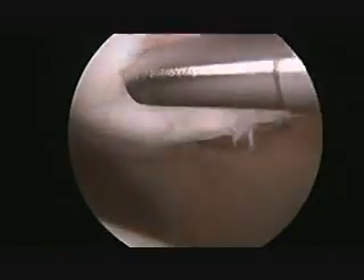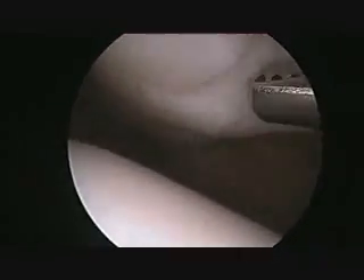A shaver is then used to remove any loose bone or cartilage. This is done to prevent any further loose bodies from forming as well as to decrease pain from the injured site.